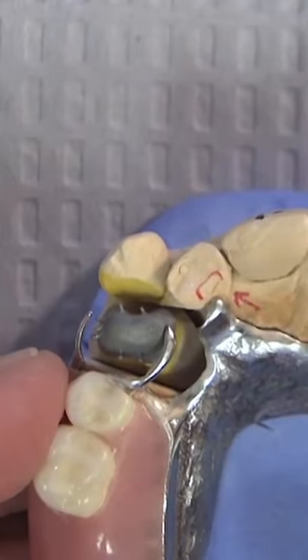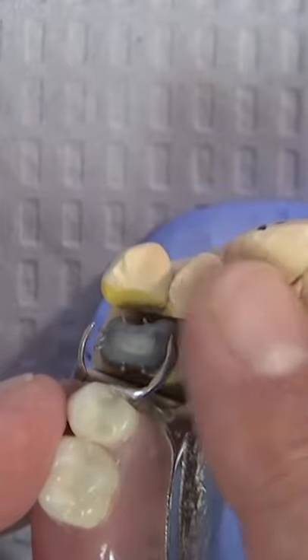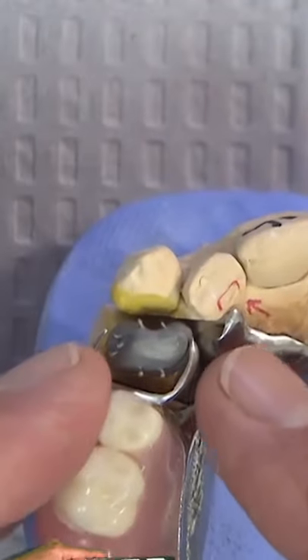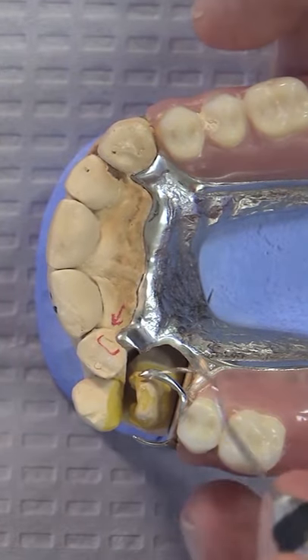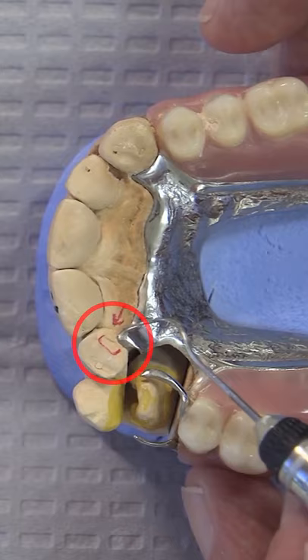We will have a model that we can pour up with the accurate fit of the partial onto the patient's arch and an accurate fit between the clasp and the metal coping itself. We can see that all of a sudden we have a little issue here — this is not sitting in the rest where it should be.